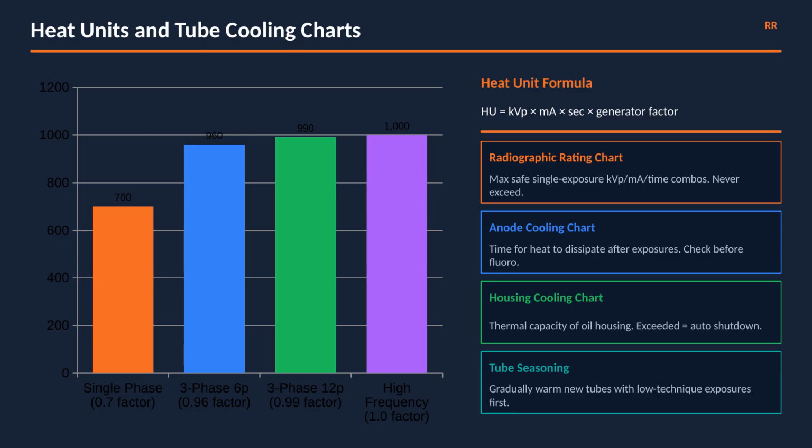3 charts govern tube heat management and must be consulted before high-demand procedures. The radiographic rating chart shows maximum safe single exposure combinations of kVp, MA, and time. Never exceed these values. Tube damage results.